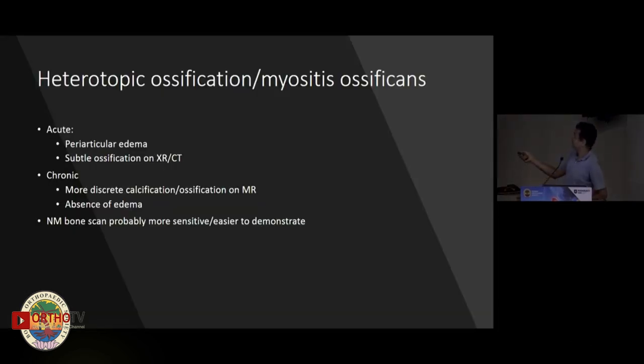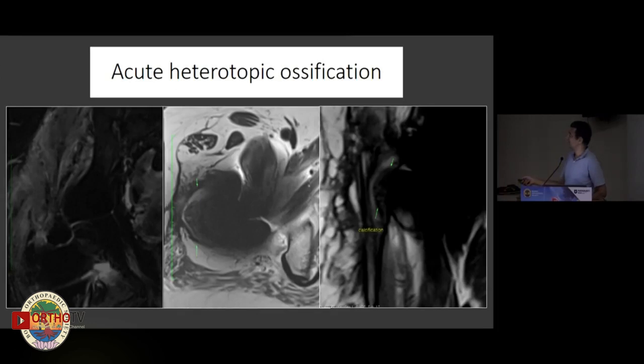Heterotopic ossification is another important finding. MR is very helpful here because beyond seeing the calcification visible on X-ray or CT, you can actually see the edema around it, which is an indicator of current activity. Here you can see edema in the gluteal muscles, the heterotopic ossification itself, and additional calcification in the region.